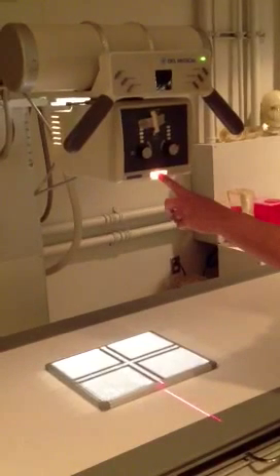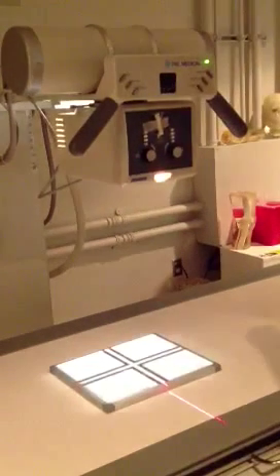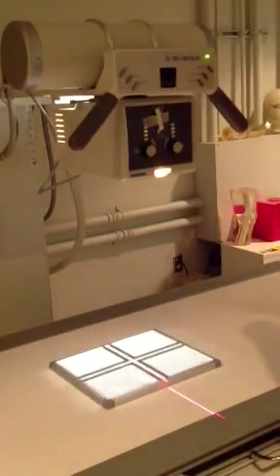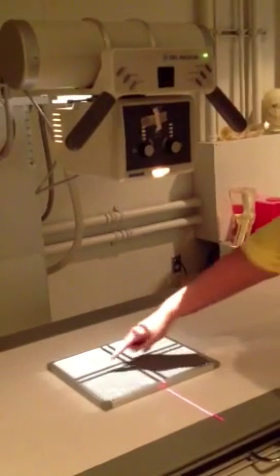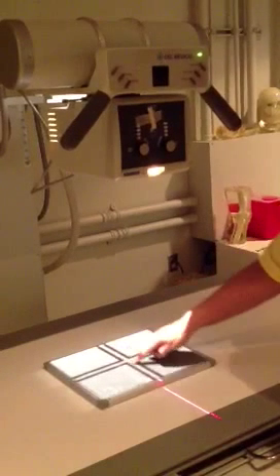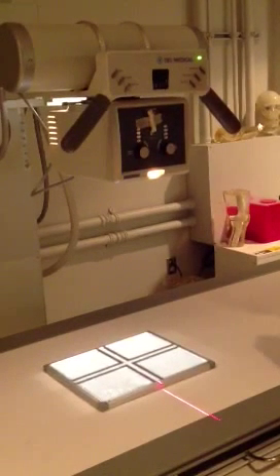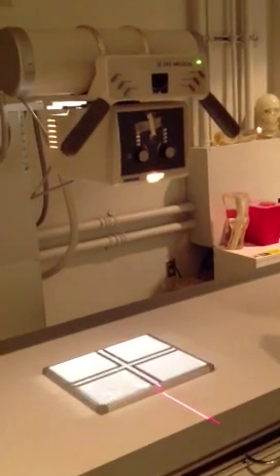So when you hit this button right here, it's going to turn the light on and off. You will also notice that you have crosshairs in here, and that is going to be the center point of your x-ray beam.